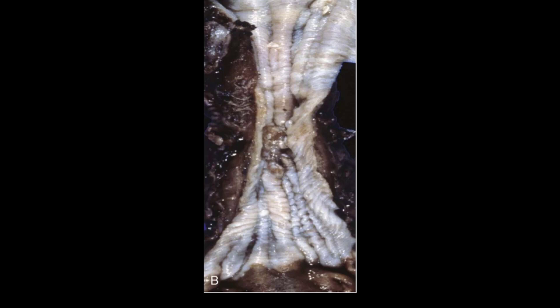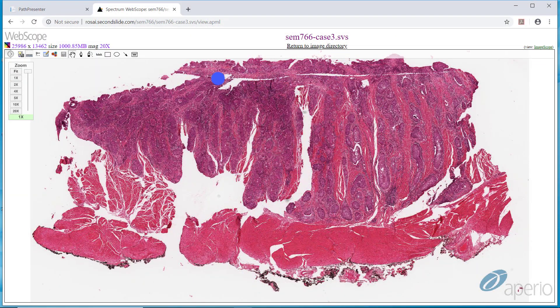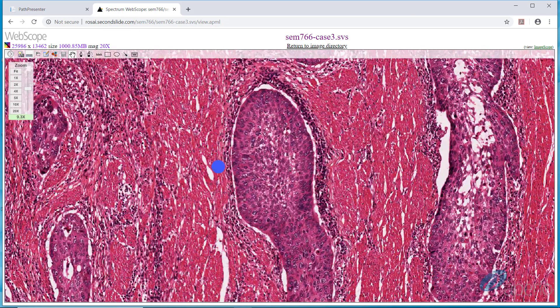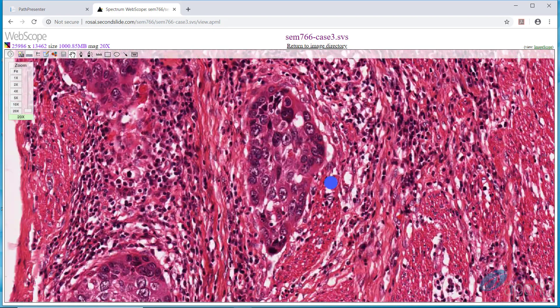Looking at the pathology slide, you can see the tumor up here, and at the bottom is the muscularis propria. Taking a look at the tumor on the right, you can see regions of abnormal squamous epithelium which is very disorganized and has highly atypical nuclei — that is the appearance of squamous cell carcinoma. In addition, the areas around these islands of squamous cell carcinoma are smooth muscle, which is evidence that the tumor is invading into the muscularis propria. This is squamous cell carcinoma of the esophagus.